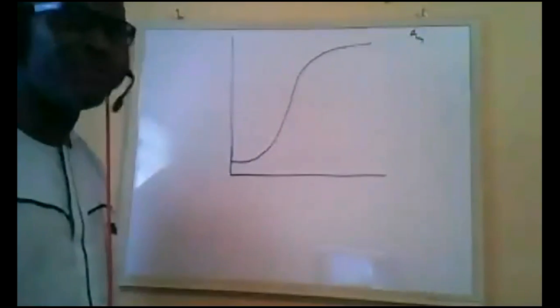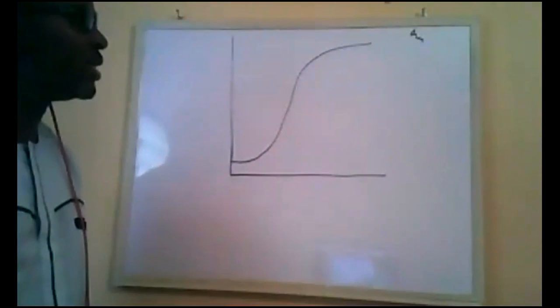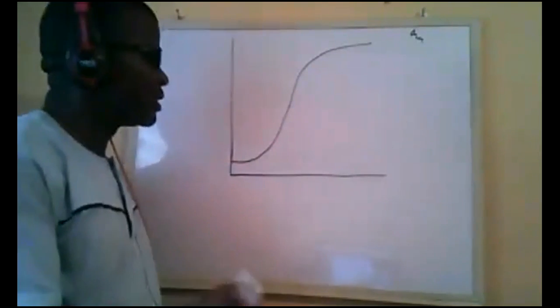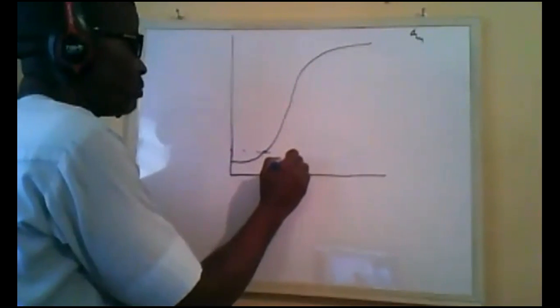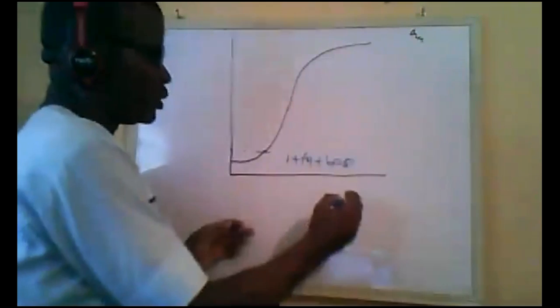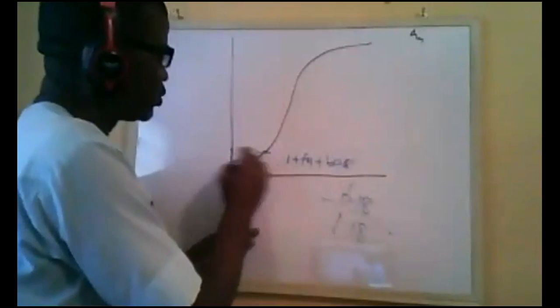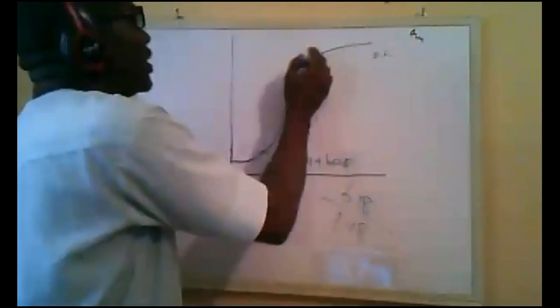But for general radiography, we want to define a particular gradient we use, and that is the average contrast, which is defined at 2 points. You take this point of 1 plus fog plus base. That is optical density of 1 plus fog plus base. And of course, we know the highest for fog plus base shouldn't be more than 0.18. So we can simply have our upper value, which is 1.18. So you just get your 1.18 here and then put it. Then you go up here. The higher limit is 2 plus fog plus base, so you can have around 2.18 here also.